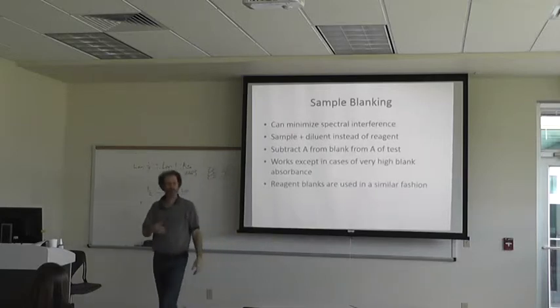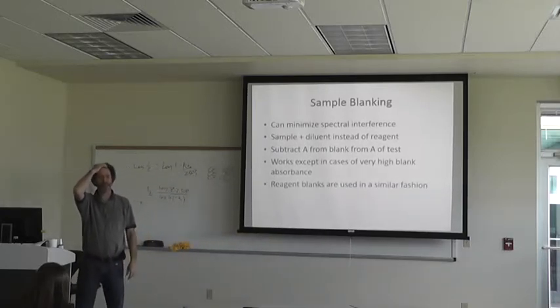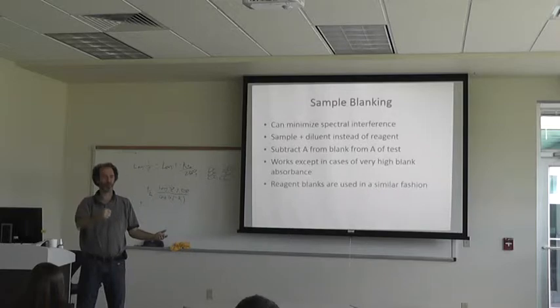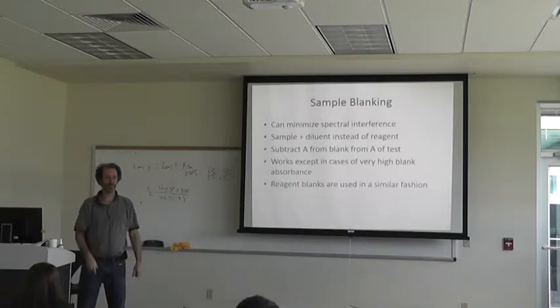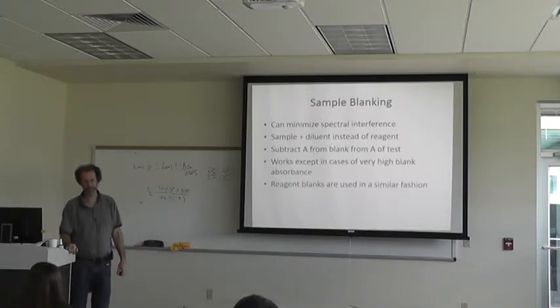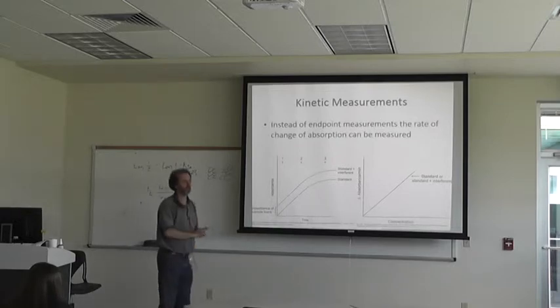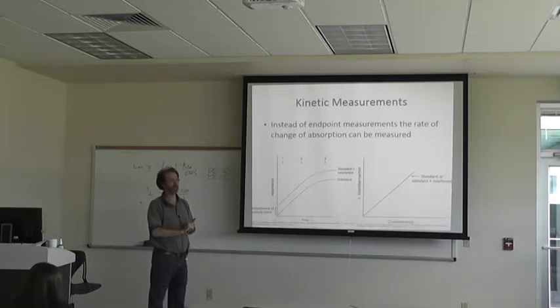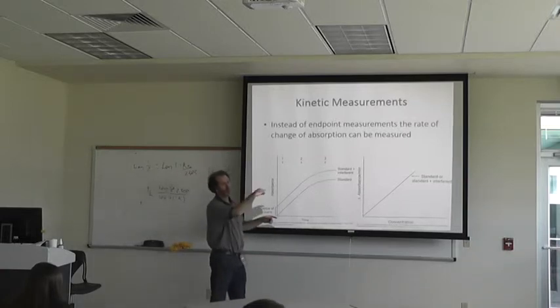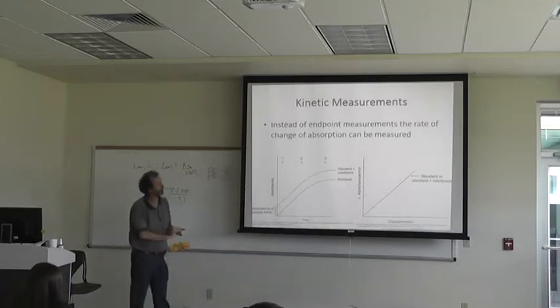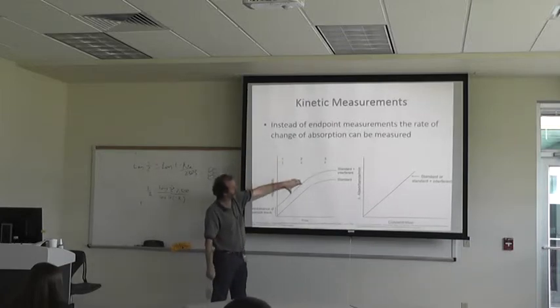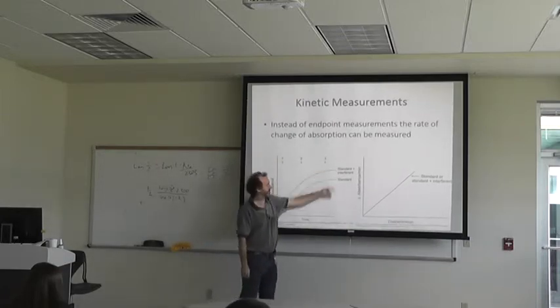Reagent blanks are used in a similar fashion — if you have reagents used in the assay that absorb light, you blank with just the reagents alone, because they contribute to absorbance too. You can get around some of these interferences via kinetic measurements, just like enzyme assays. You do several time points rather than endpoint measurements — the rate of change of absorption can be measured — and that will eliminate interference effects.